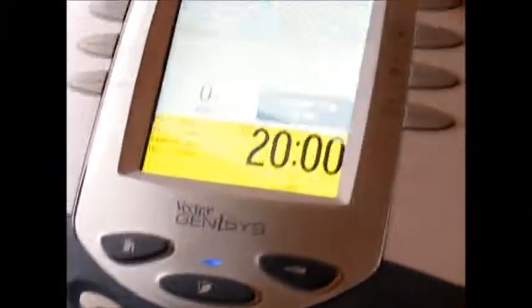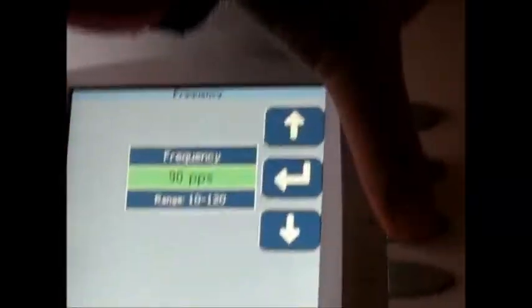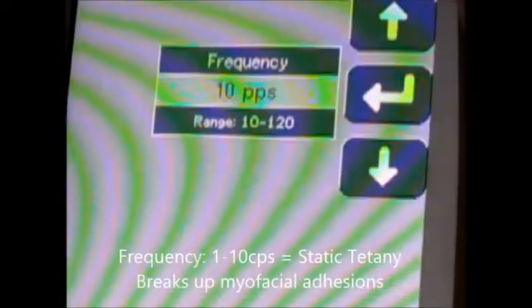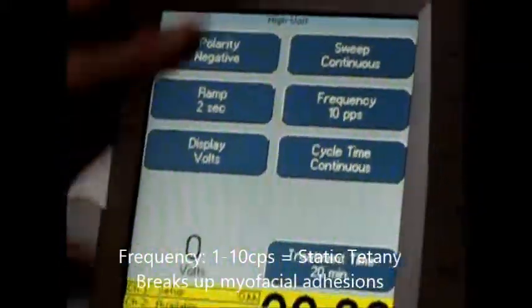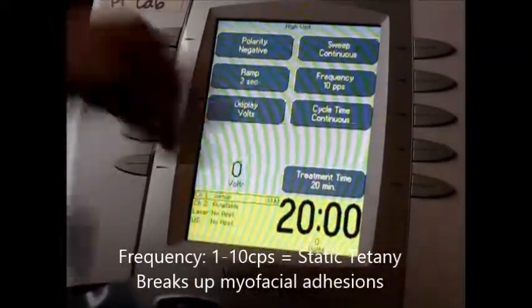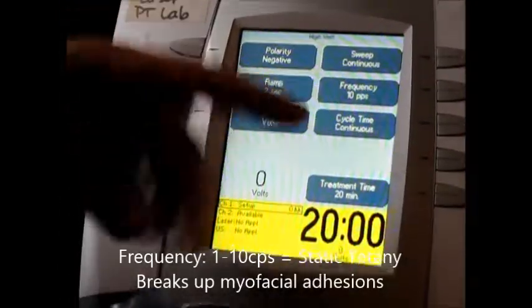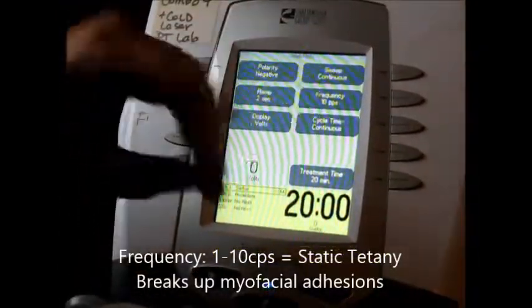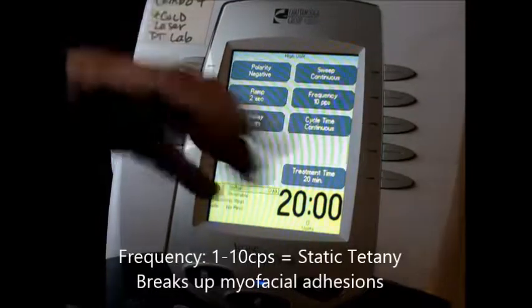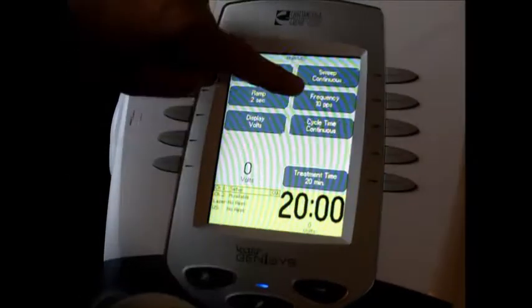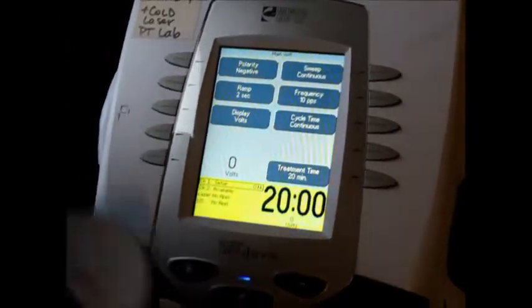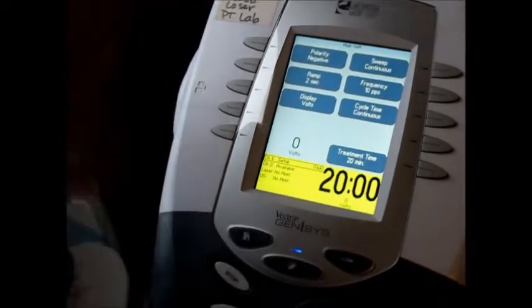The second thing is I need to set the correct frequency. Let me review the frequencies with you. If you set a frequency from 1 to 10 cycles per second, this is going to cause a twitch that pulses — in this case, 10 cycles per second. If you set it down as low as one, you'd see only one cycle per second. This is the frequency used for breaking up myofascial adhesions and is called static tetany.